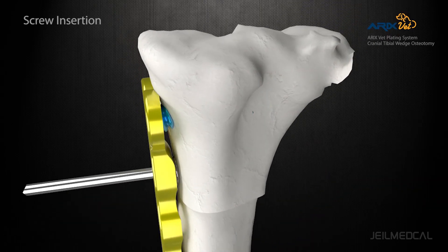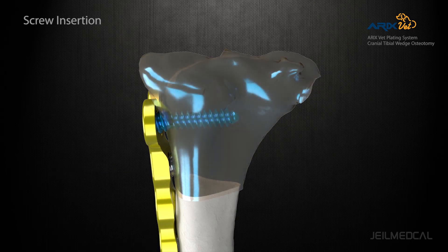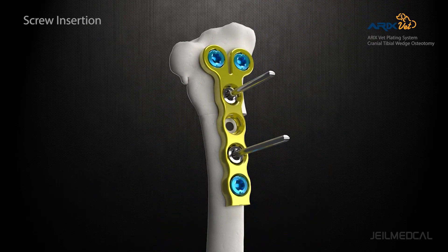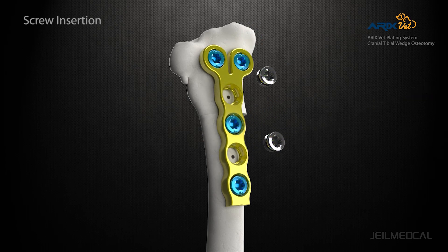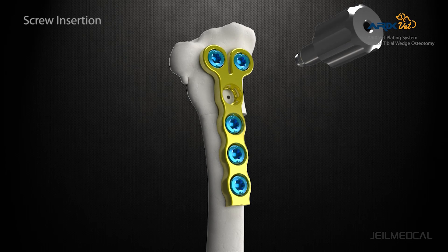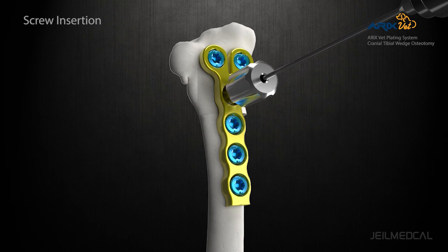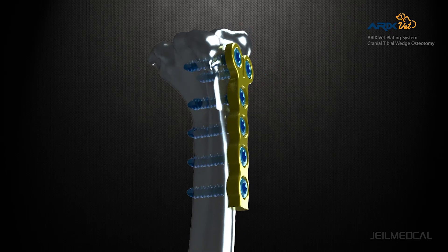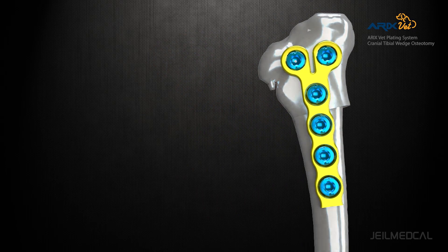The plate holes are applied with our patented variable angle mechanism that allows 15 degrees variable angle from the screw axis. The proximal part of the tibia will be angled cranially.